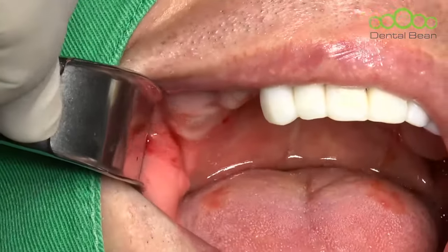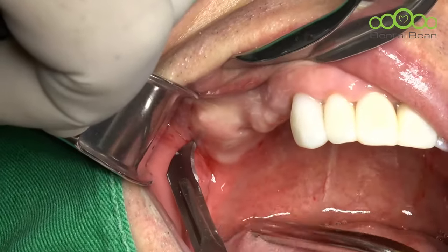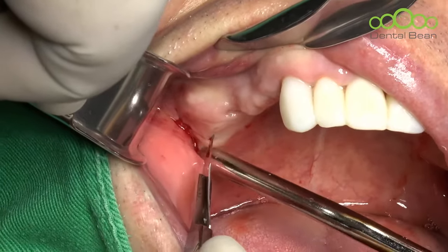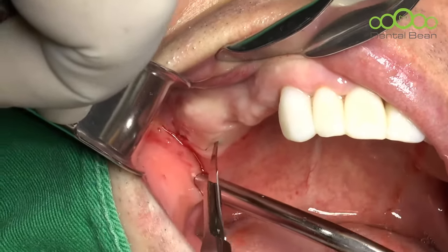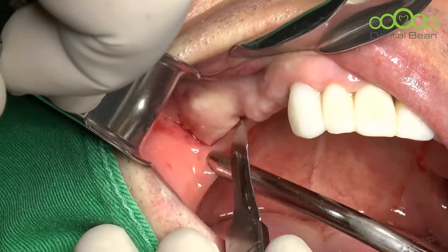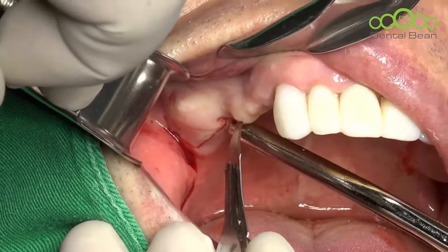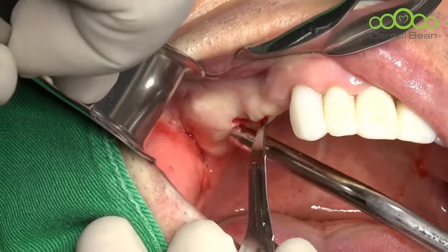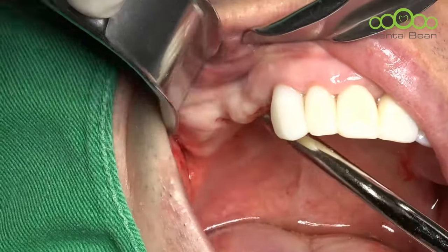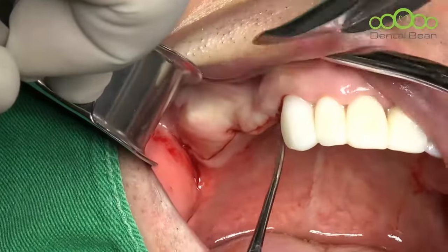I'll make the incision from the buccal side of the maxillary tuberosity and move slowly. The ridge is irregular, so I'll move very slowly. The advantage of using number 12 surgical blade is that if you move slowly and touch the bone, just one stroke, you can finish the incision, because number 12 surgical blade makes point contact. Maybe this side needs no vertical incision, so I'll open the flap.